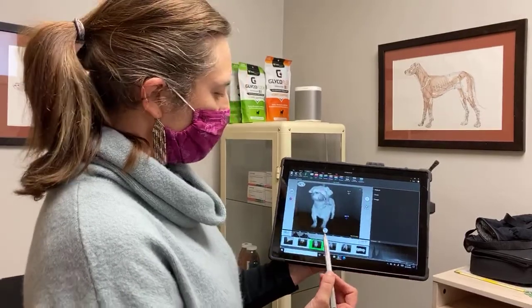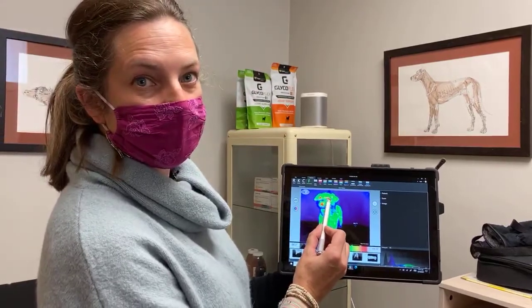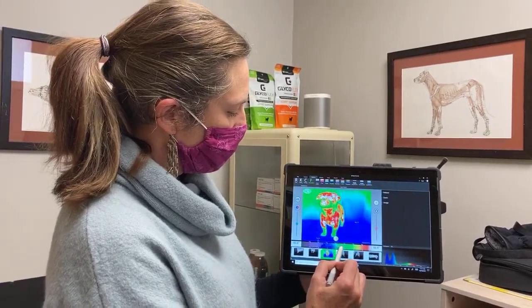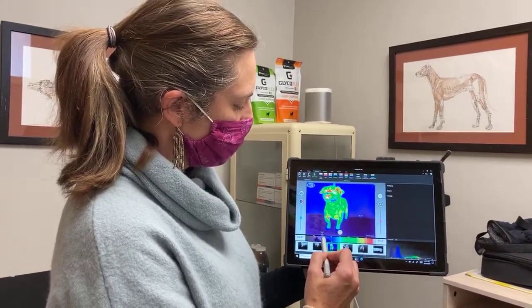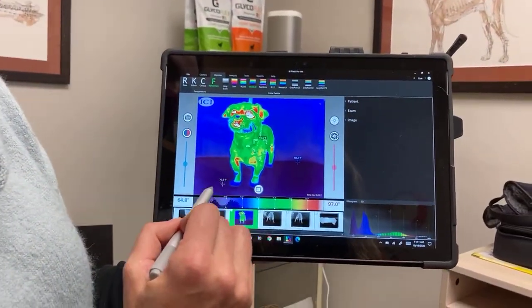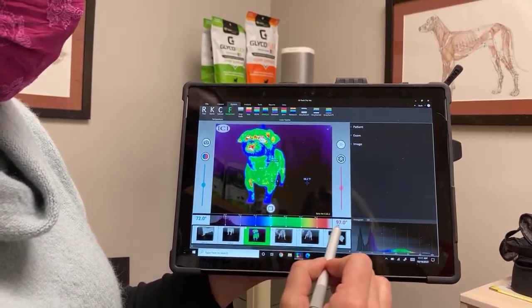Here is the actual photograph and then we're going to turn some colors on. In this picture we can see his eye — that Sam caught so well — is one of the hottest parts of his body, which is normal. If we change the temperature range we can adjust the color spectrum; we want more colors visible for better detail. The coolest parts of his body are generally going to be the tip of the nose and the tip of the feet. In the winter, Sam and I can tell how cold those feet get from being outside.